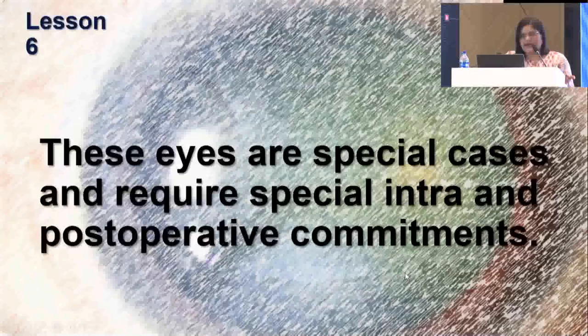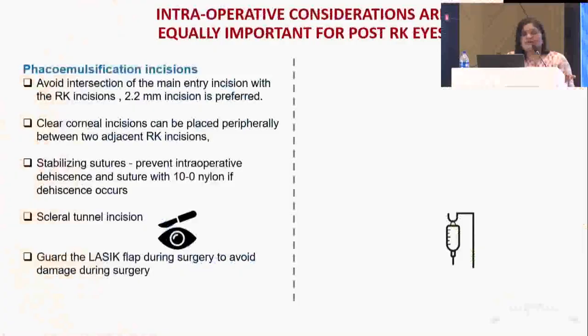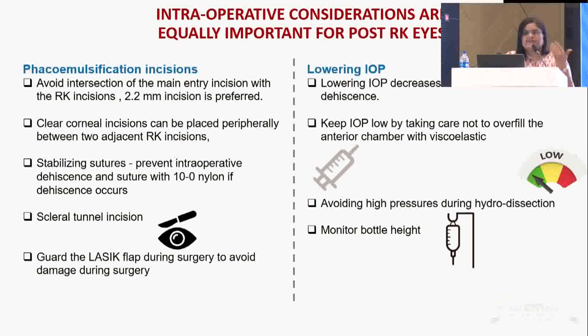These are special cases, and they need special intraoperative and postoperative care. We have to avoid the intersection of the main entry, and a 2.2 or 2.4 incision can be preferred. Clear corneal incisions can be placed peripherally between two adjacent RK incisions. Stabilizing sutures can be used. Scleral tunnel or scleral incisions can be done, and we have to remember to guard the LASIK flap during the surgery if there is a LASIK flap involved. The lowering of IOP has to happen during the surgery. It should not be very high, nor too low.